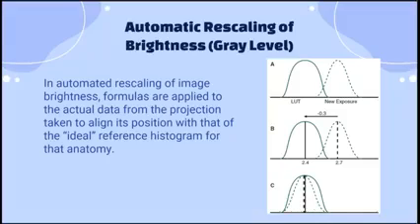Okay, so it will not rescale automatically, or it will not adjust the brightness automatically, if the field edges, or the collimated edges, were not detected by the partitioned pattern recognition software, or if there is unexpected material such as metal in the field of exposure, and the contrast media put, of course.